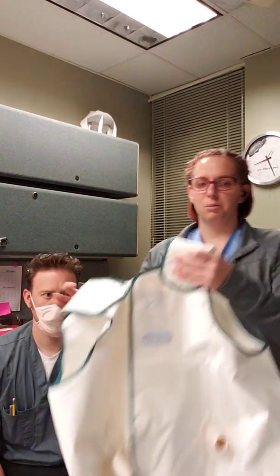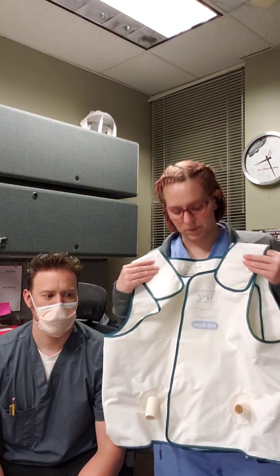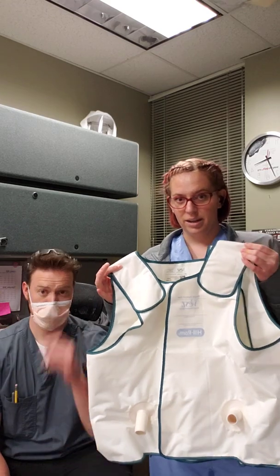Another piece of equipment that's used is the vest. There are two types of vest you will use. We have the kind that we use mostly for our cystic fibrosis or ambulatory patients. You will fit this one, which is a large, so you'll put it on and you'll want to make sure that there is a fist distance between the patient's chest and the outside of the vest.